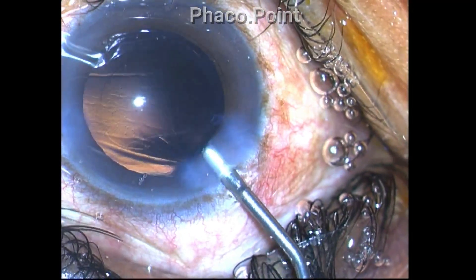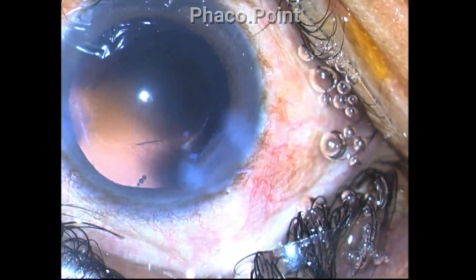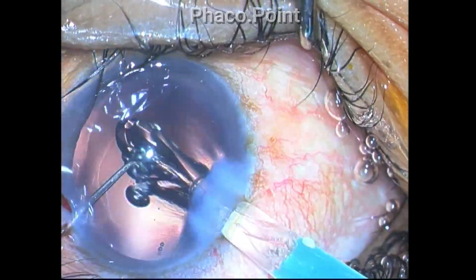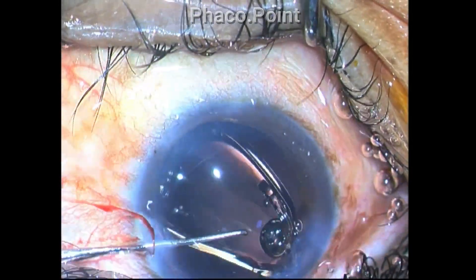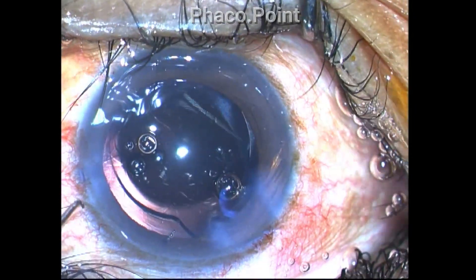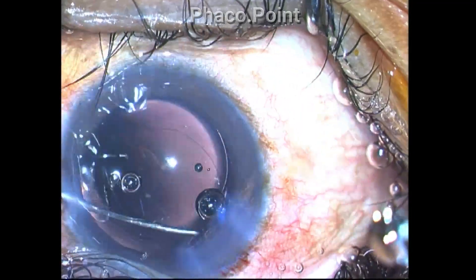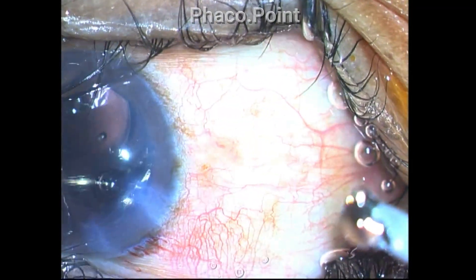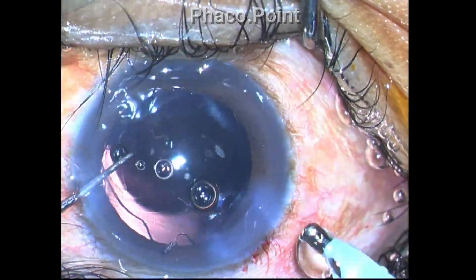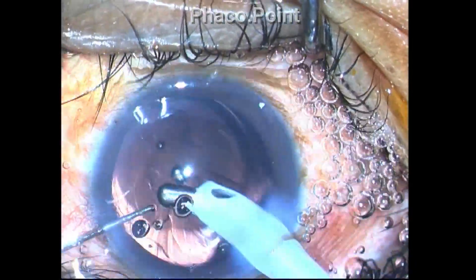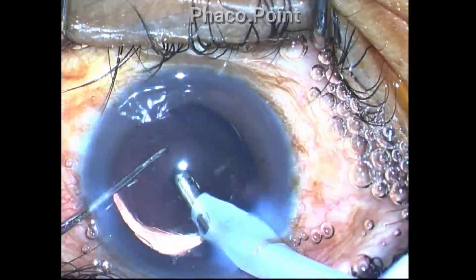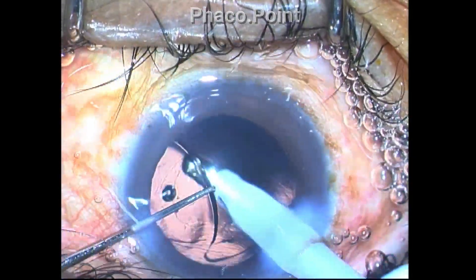The problem started when I attempted to implant the intraocular lens. This was a hydrophobic acrylic intraocular lens, and I'm using an undue amount of force in order to coax the trailing haptic inside the capsular bag. Remember that sometimes it's better to dial the trailing haptic into the bag rather than just push it in a posterior direction. When I attempt pivot rotation, there's a resistance to pivot rotation, as you can see.